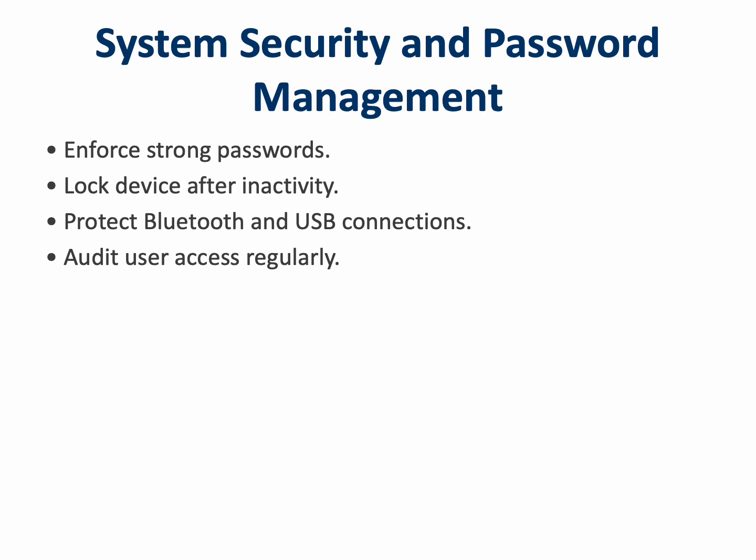Security on biomedical devices extends beyond patient data. It includes configuration integrity. Set strong passwords using a mix of letters and numbers, avoiding predictable patterns. Enable auto-lock after a short period of inactivity to prevent unauthorized use in open environments. If the Rigel 288 Plus connects via Bluetooth or USB, ensure only approved devices are paired. Review access logs periodically to identify unusual activity. These precautions prevent unauthorized changes and help ensure that every test carried out is verifiable and compliant with your department's security protocols.